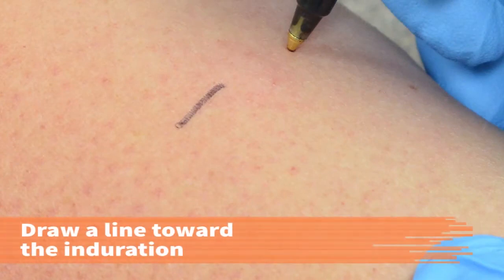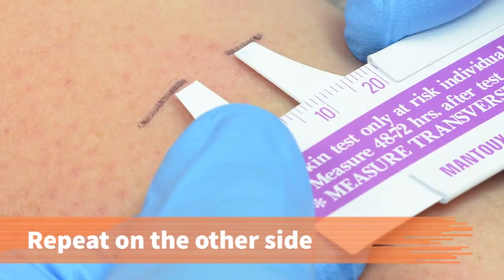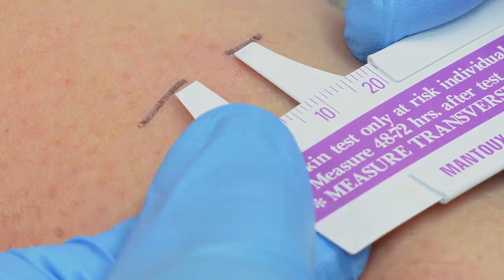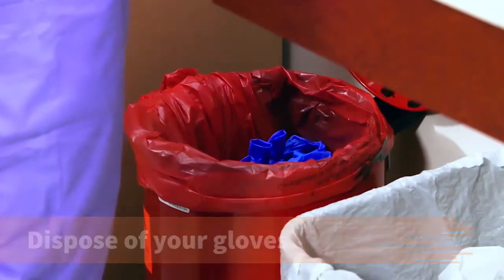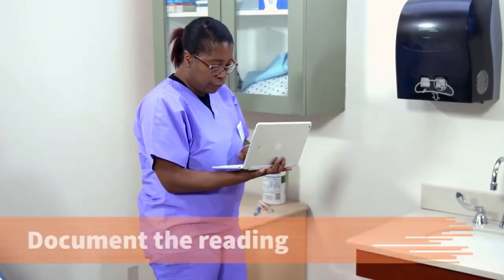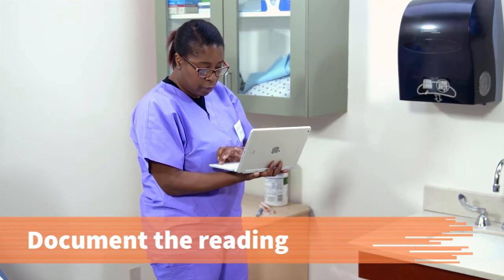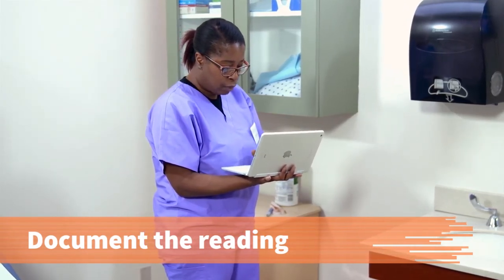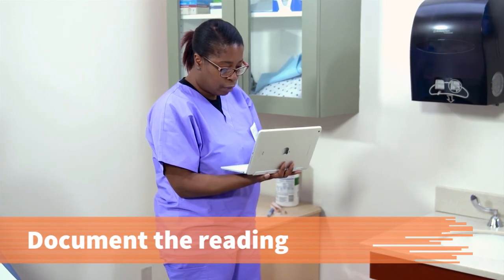Using a ballpoint pen, draw a line towards the induration from the outer edge of the arm. Repeat on the other side. With a disposable millimeter ruler, accurately measure the distance between the 2 points. Dispose of your gloves in the biohazard waste container. Then sanitize your hands. Document the reading in the patient's health record. Include the reason for the patient's visit, the arm read, the size of the induration in millimeters, and the provider notified.